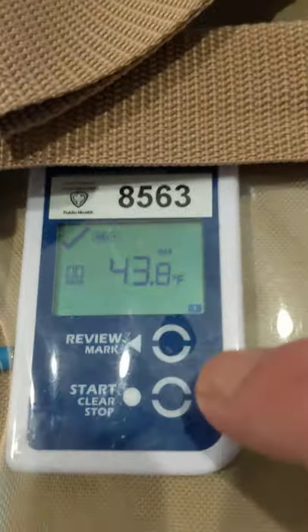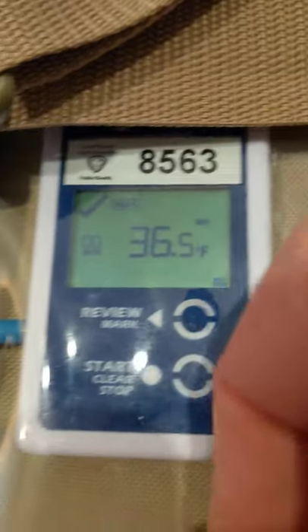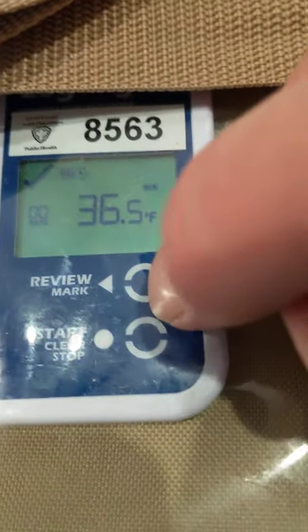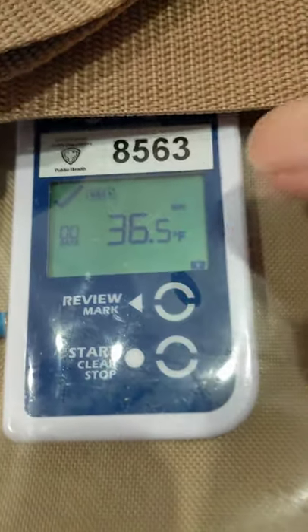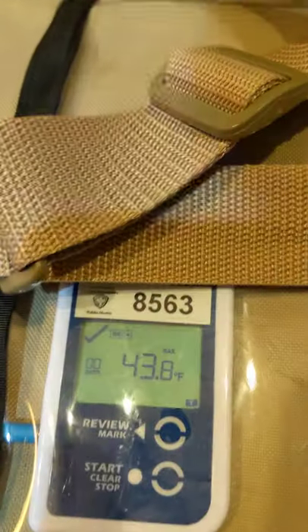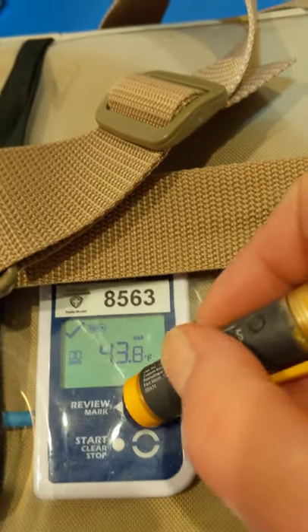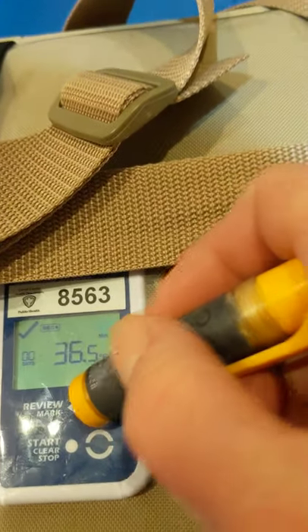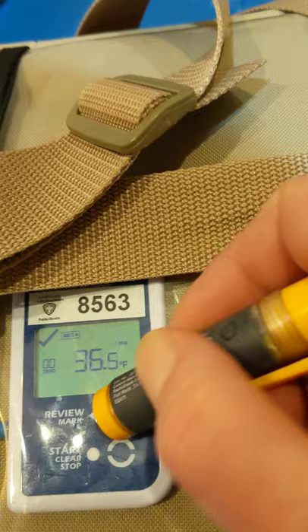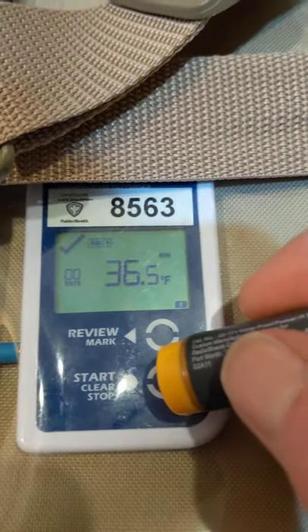These buttons — you have to put a fair amount of direct pressure right on that circle with the flat of your finger. Some people have been using their thumb, which can damage the plastic, so it's better to use the flat of your finger, or if you're having difficulty, use anything like a pen or thermometer that you can apply pressure with. You can see it going.